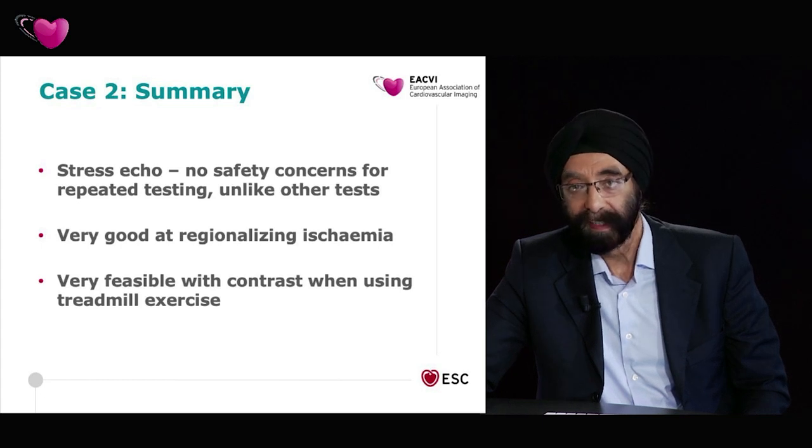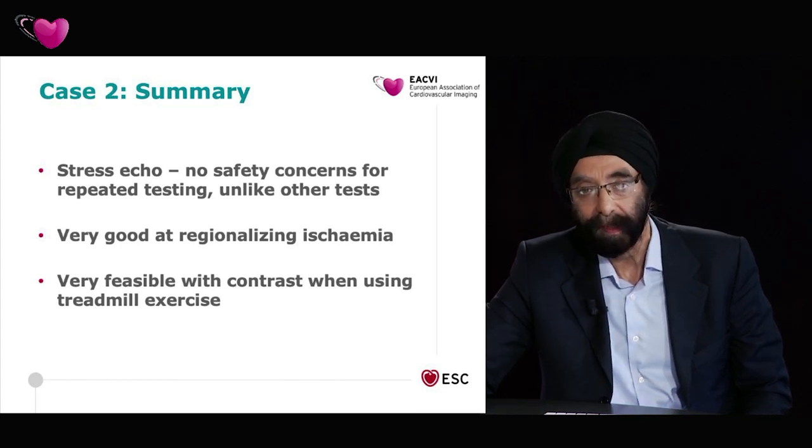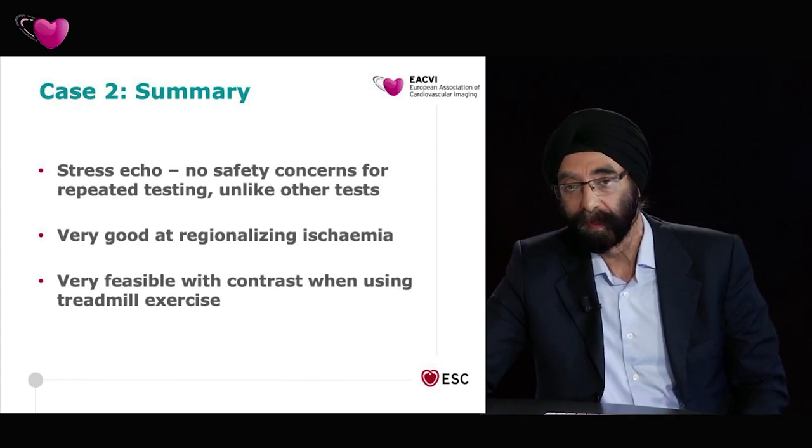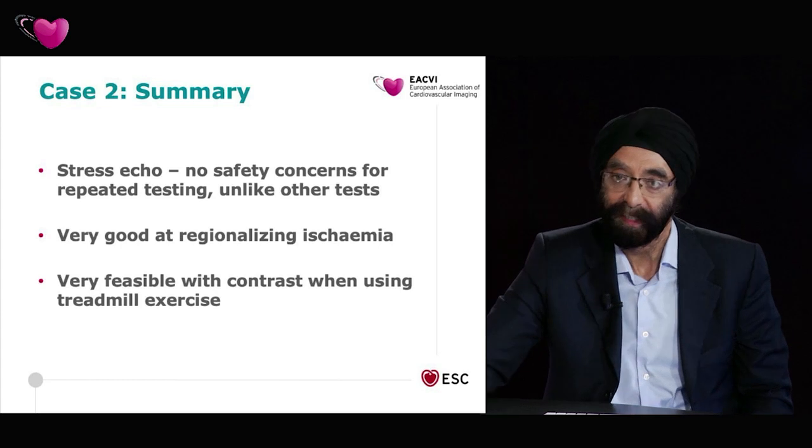Very good at regionalizing ischemia. We've shown infralateral ischemia, we've shown lateral, septal, apical. If you have good images, you can very happily do treadmill exercise with contrast. So these are the main learning points from this case. Thank you for your attention.